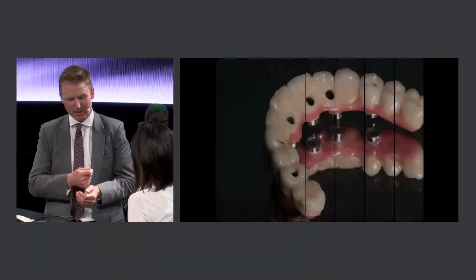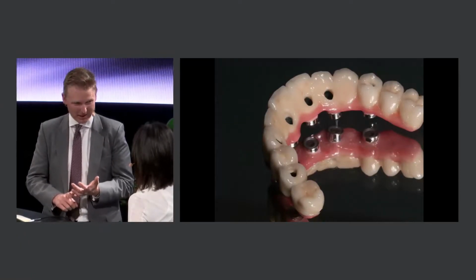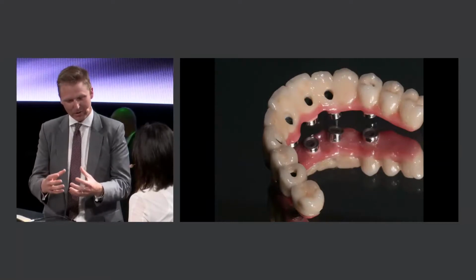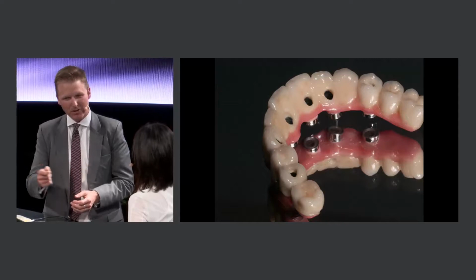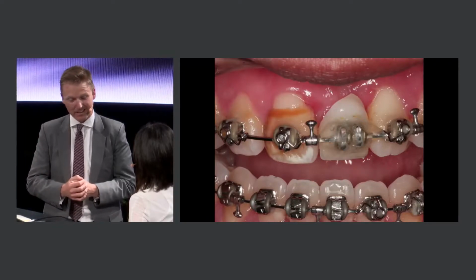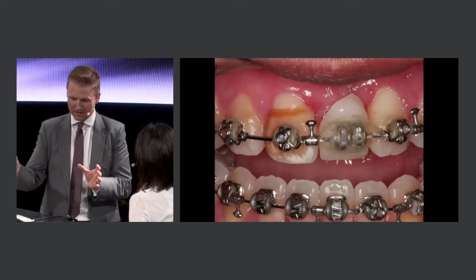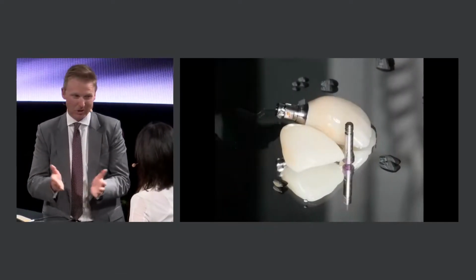And what we can do there is we can take an intraoral scan reliably and know that there are landmarks that we can register in the teeth. There's an area of gingival tissue and then obviously the bone support underneath it. And we know that the intraoral scanner can pick that up pretty easily. We can then take the patient in and take a cone beam CT, and with that data from the CT and the data from the scan, that can then be merged and funneled into co-diagnostics.